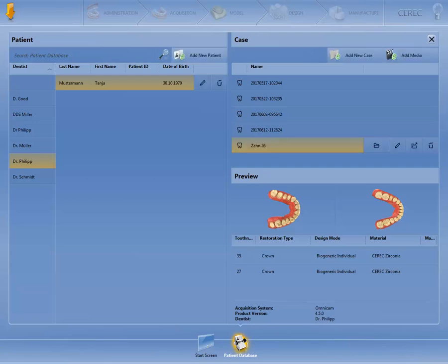Individual cases can also be exported or erased. The case highlighted in orange is always the one that is erased. Clicking on Add New Case takes you to the administration phase, where you can create the restoration.